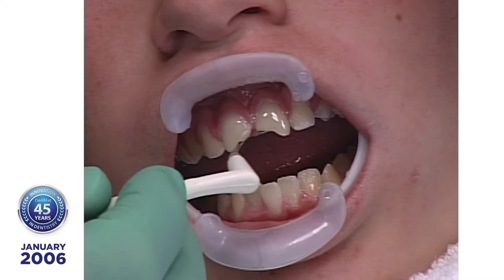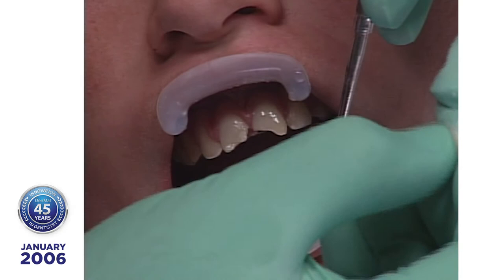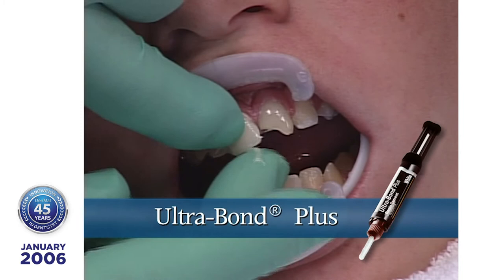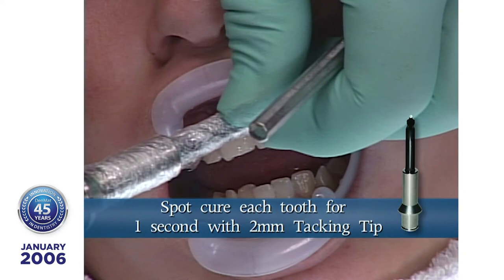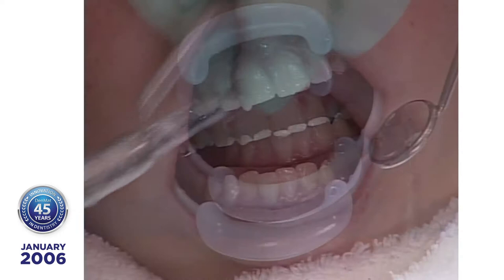Seat the lumineers on the teeth using Ultra Bond Plus Resin Cement with enough force to extrude all excess resin. Clean up excess cement with a brush dipped in Tenure S unfilled resin, then spot cure with the Sapphire Light and the 2mm tacking tip for 1 second per tooth. The remaining uncured cement can then be brushed away before final curing. Note, there is no need for interproximal matrix strips.